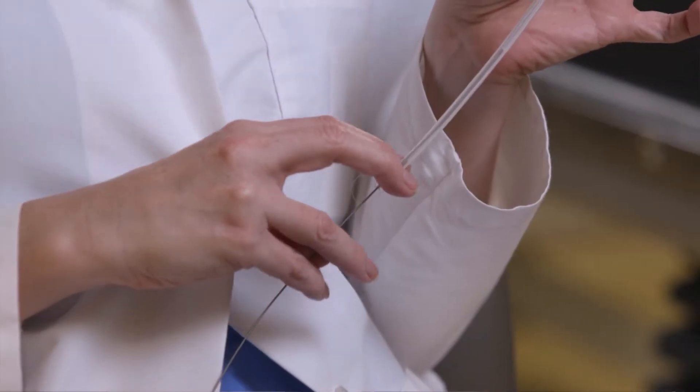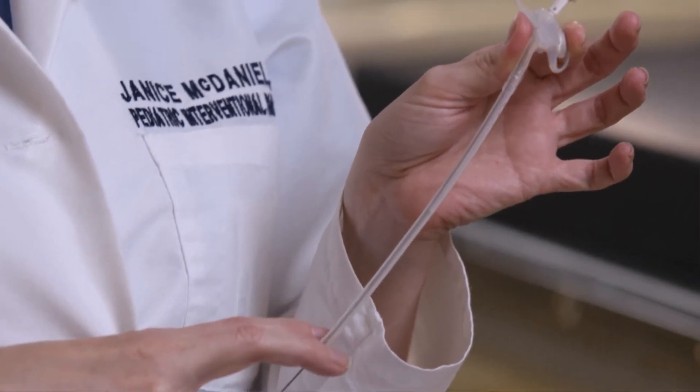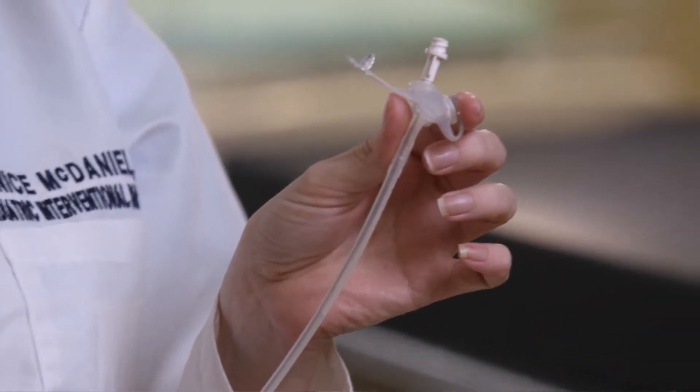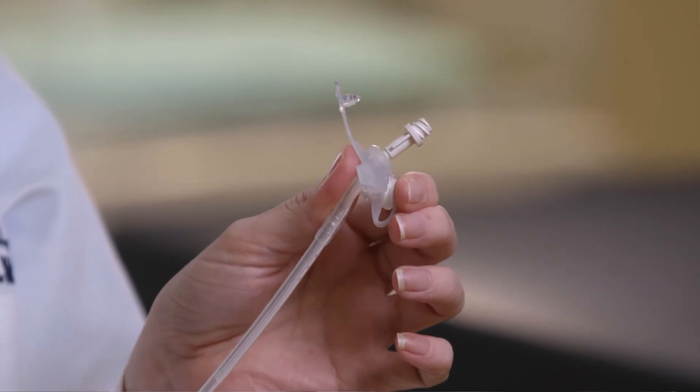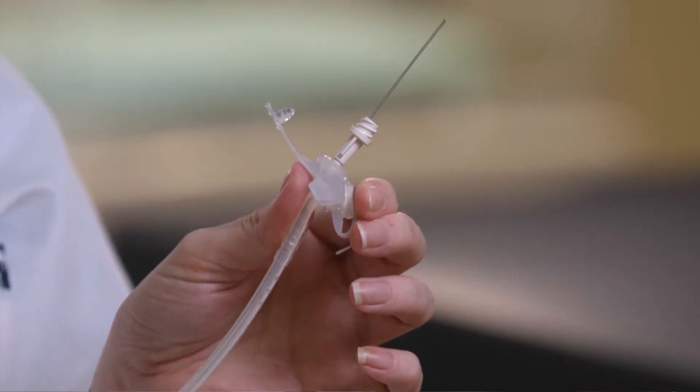When you're backloading the catheter over the guide wire, in order to straighten out the tracks from the jejunal port to the tube, you can put your thumb right in that crease, give a little pressure, and then when you push the wire through, it should come out every time.